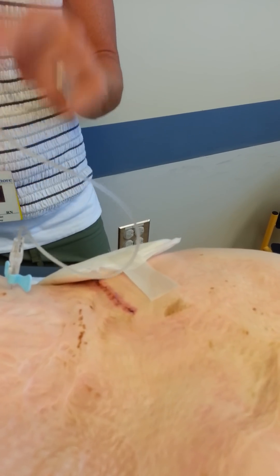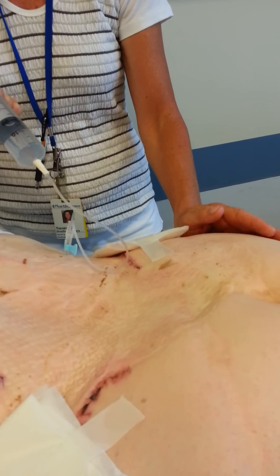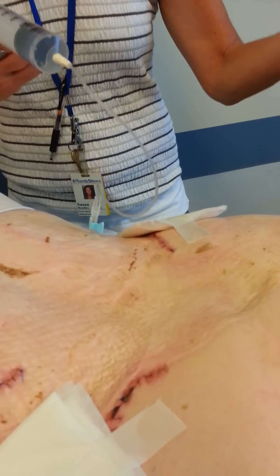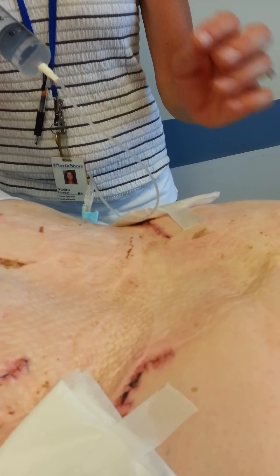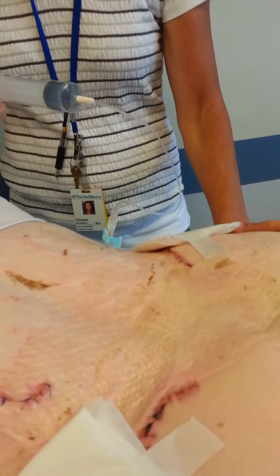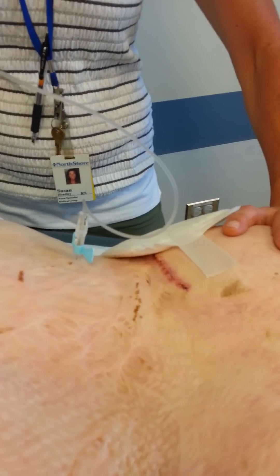So if there's too much, then what? Well, just as you're putting in — great question — you can pull it back out. Sometimes, and it's so rare, people have put too much in, pulled the needle out, and thought: I don't like the color, I don't like the way it feels. Give it 15 minutes before you do anything, and typically it starts to pink up. If it didn't, the worst thing is you'd have to go back in with an empty syringe, a new needle, re-sterilize the area, access it, and draw some fluid out. It's very rare that they're overfilled — if anything, it's underfilled.